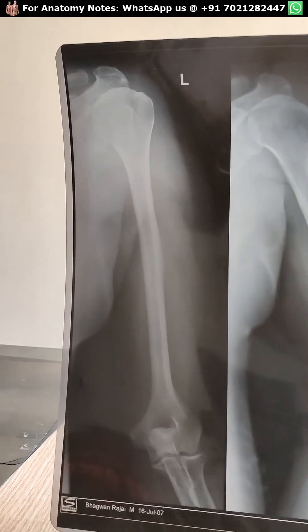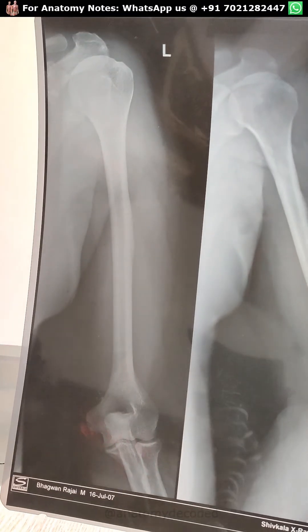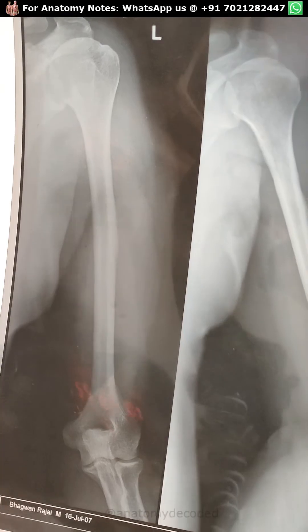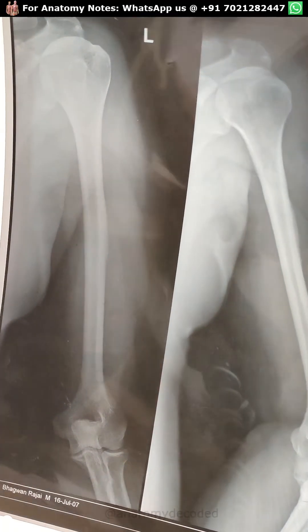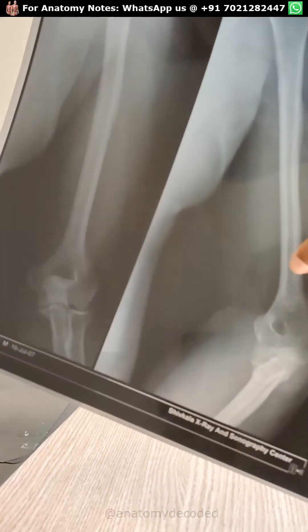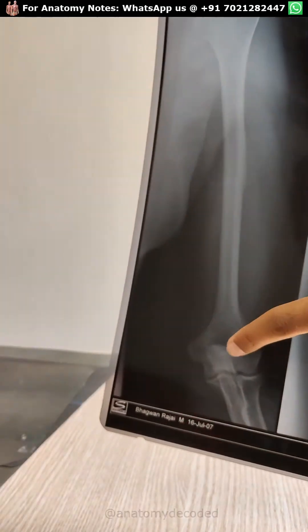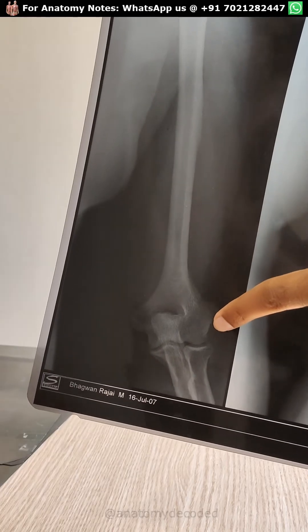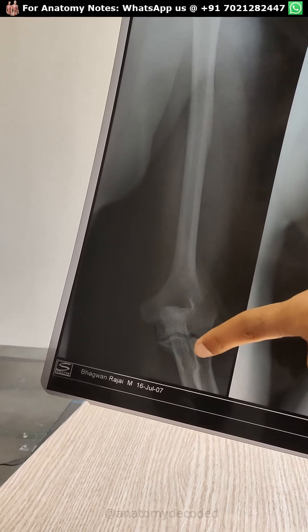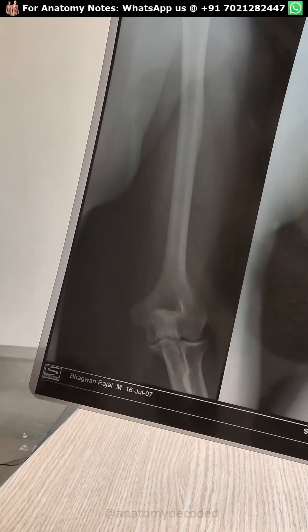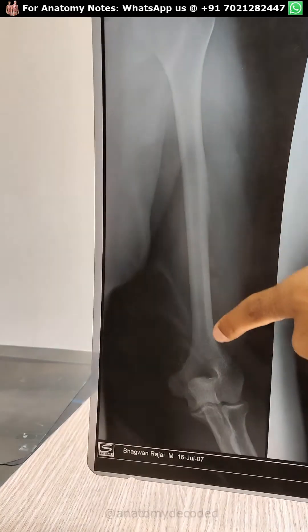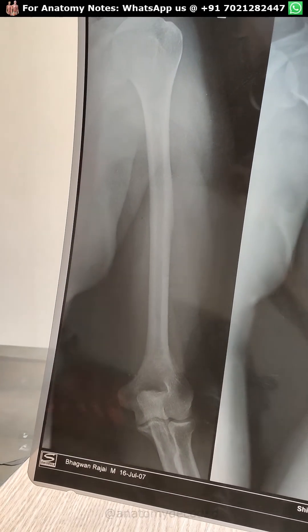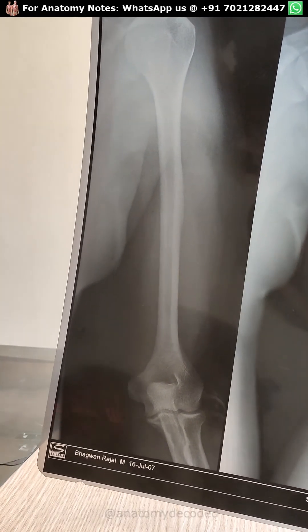This skiagram shows the shoulder joint as well as the humerus — it is the skiagram of the arm, also left arm because 'L' is mentioned. Humerus is the bone of the arm. We can describe the humerus in its entire extent: the head, the neck, the shaft, and the lower end of the humerus. The lower end has projections referred to as medial and lateral epicondyle — the larger projection is the medial epicondyle and the other is the lateral epicondyle. Some upper part of the radius and ulna are also visible; radius is the lateral bone, ulna is the medial bone. This x-ray is mostly taken to check for fractures of the humerus.